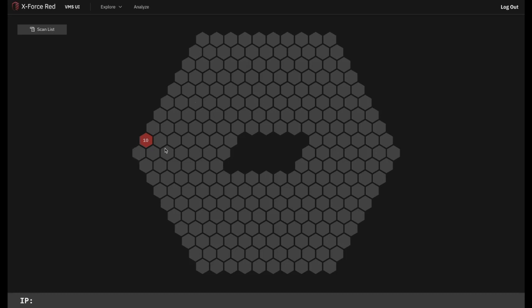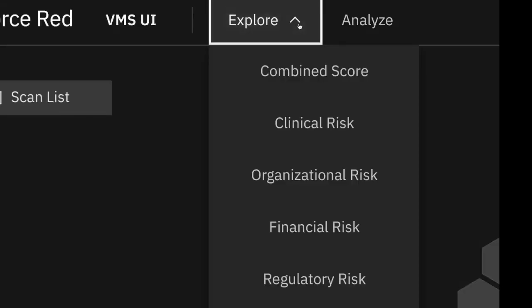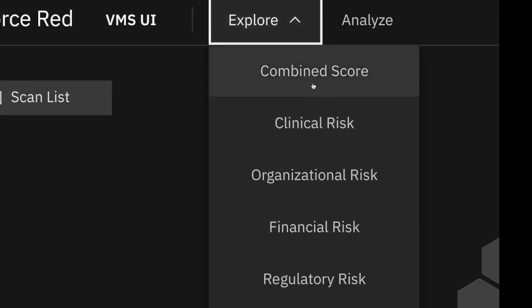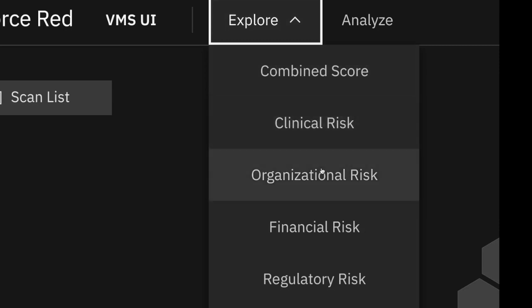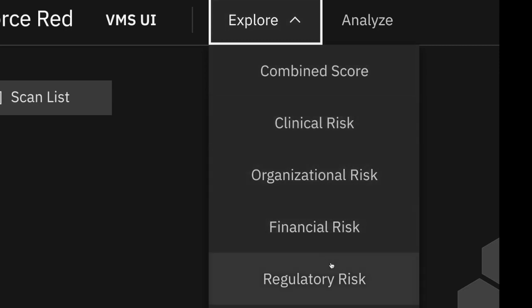Before we dive further into the vulnerabilities within this particular hospital network, we have to highlight one more powerful feature and that's the ability to access CECOM Squared analytics. We do this by clicking on the Explore tab. Using this, we can alter how vulnerabilities are prioritized within the heat map based on real-time analytics derived directly from the CECOM Squared platform.